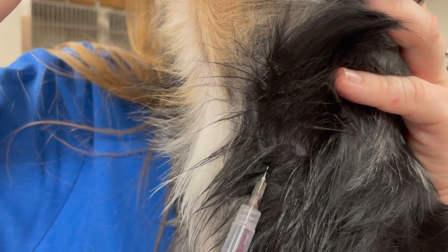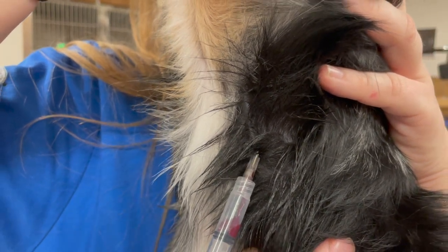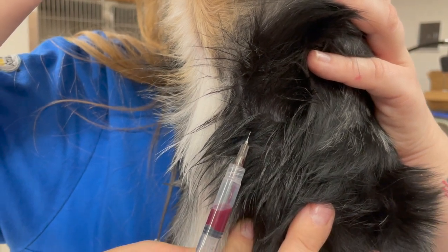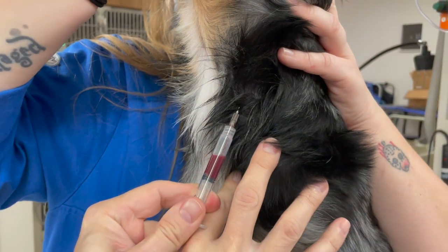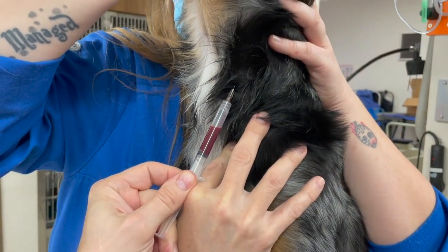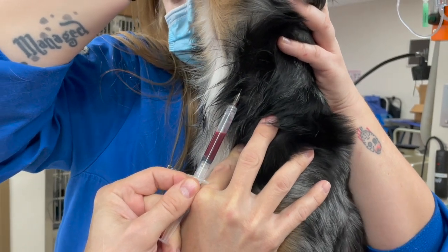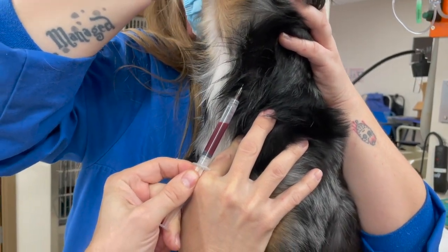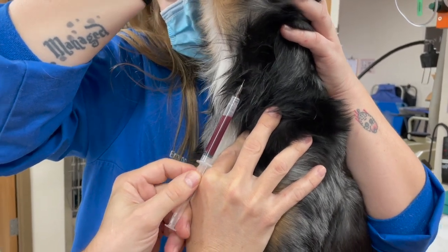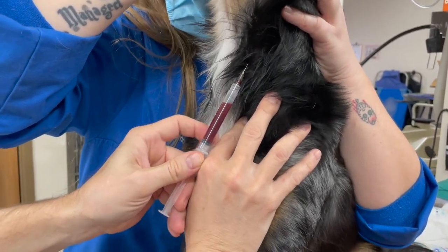Once it's in the vein, I want to hold that needle still. I'm bracing my hand against my other hand, which will move with the dog if the dog moves — both hands will move together. I'm trying to hold the tip of the needle still where it is and let it just flow into the open syringe. I'm just not pulling too hard on the suction; I'm just creating an empty space and allowing the blood to flow in.